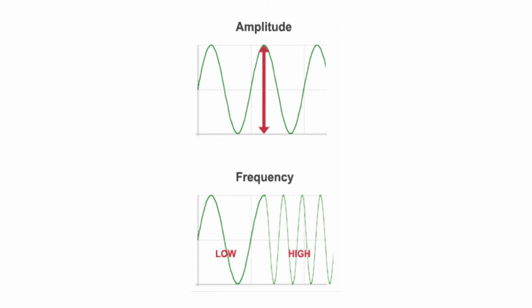Frequency, measured in hertz, is the number of oscillations per unit of time. As the name suggests, ultrasound frequencies are well above the level that can be perceived by the human ear, that is, greater than 20,000 hertz. The A-scan probe emits sound at a frequency of 8 or 10 megahertz, 8 or 10 million hertz.